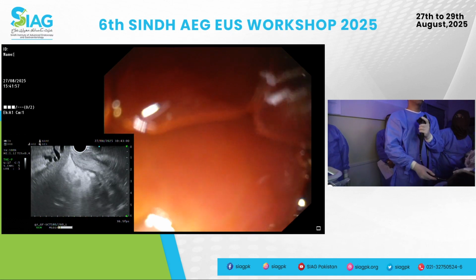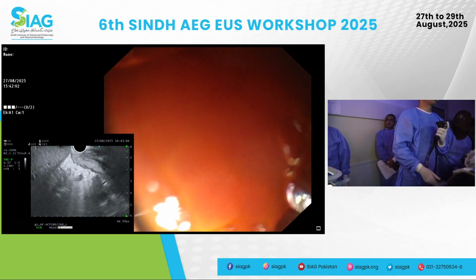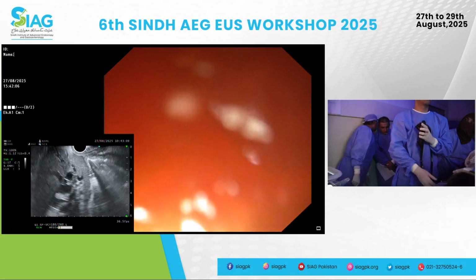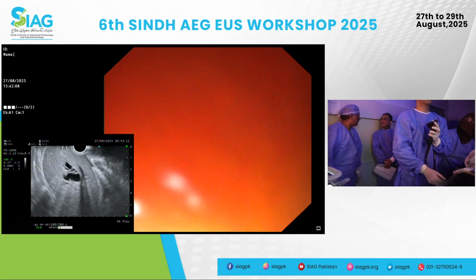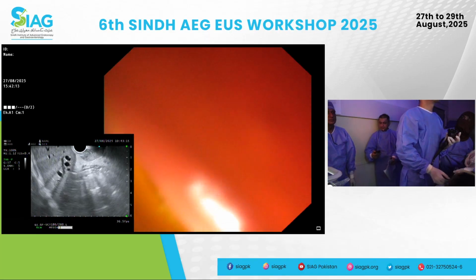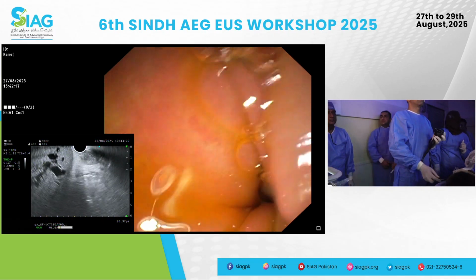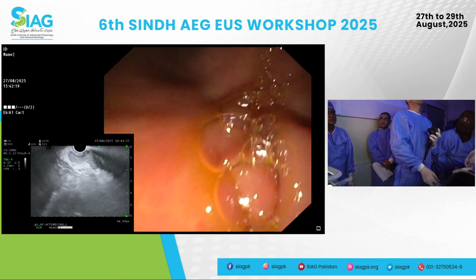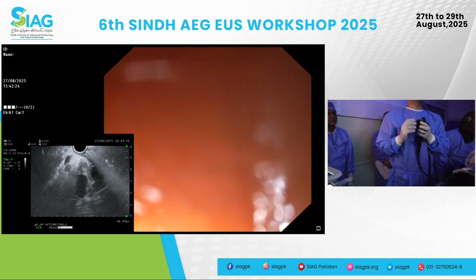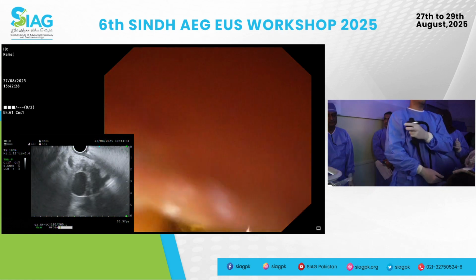So remember, as Dr. Hassan said this morning, sometimes what you have to do is use a small wheel to the right just to align it. And it should land. Yeah, you're on the ground. But it is a bit narrow. Yeah, I think it's just the position. So I should not be sort of forcing my way in. It should go in nicely. That's it.